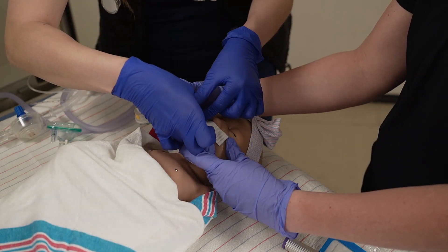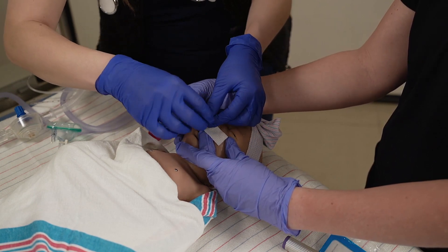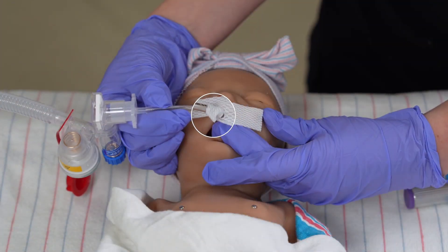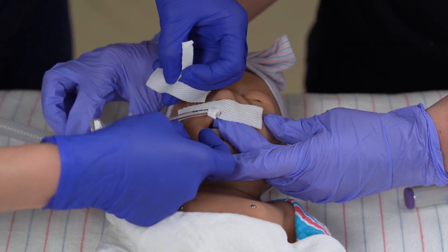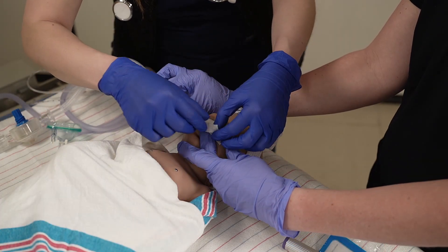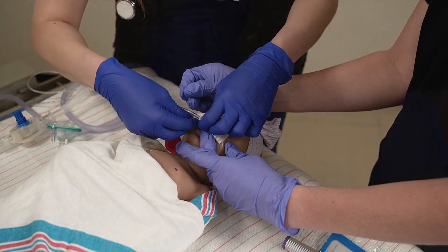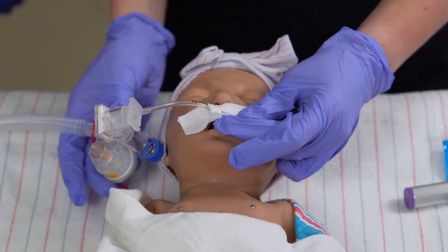Place the top strip of the Y-shaped tape on the upper lip. One strip will wrap around the tube and then wrap upward. Ensure you leave a tab at the end of each strip to make it easier to remove later. The second Y-shaped strip will be placed on top of the other tape on the upper lip, facing in the opposite direction. That strip will also wrap around the ET tube and then upwards. Verify that the ET tube remains at the previously determined measurement at the lip or gum.